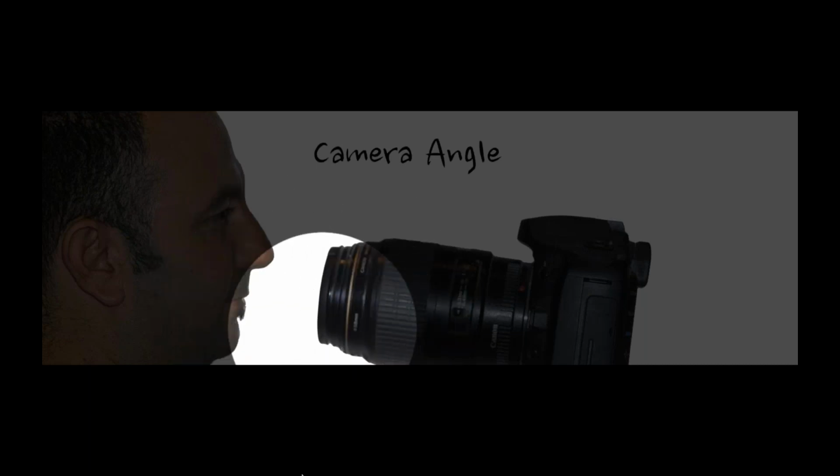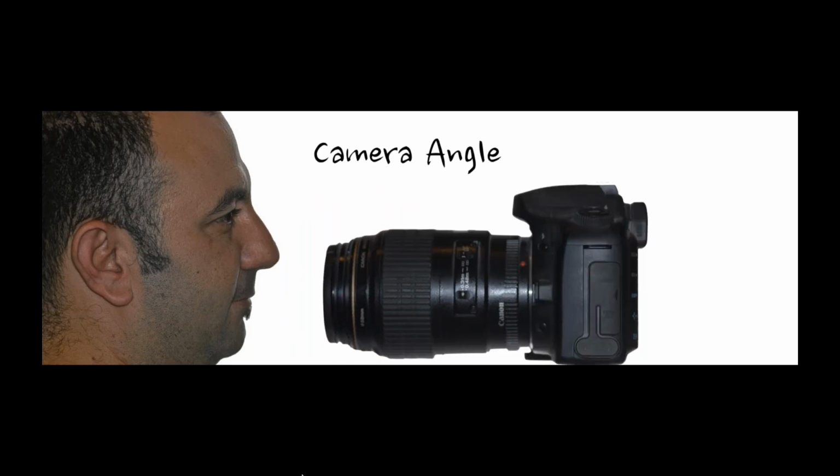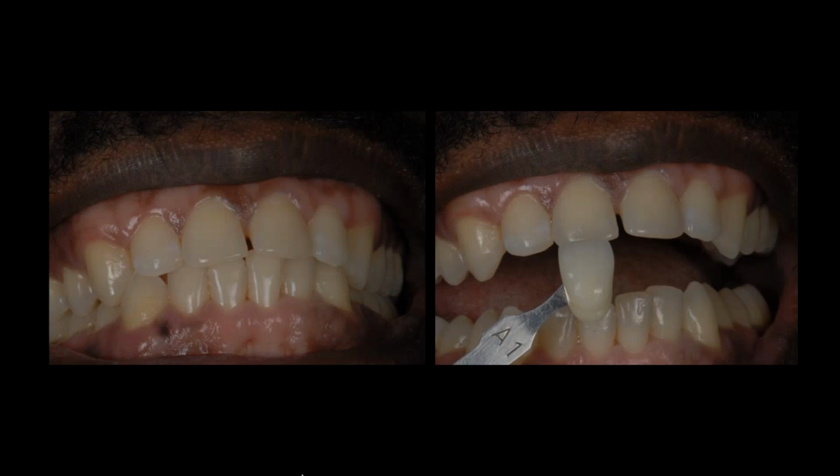So what you see here right now is what I would say is incorrect. That angulation shooting up at the patient is wrong. What I want to do is move that camera up to be more at a level, flat plane to flat plane, or even be slightly higher in my angulation. So I'm coming down, same angle camera to the same angle of the flat plane of the facial of the teeth. And that's what's going to give us the best information.